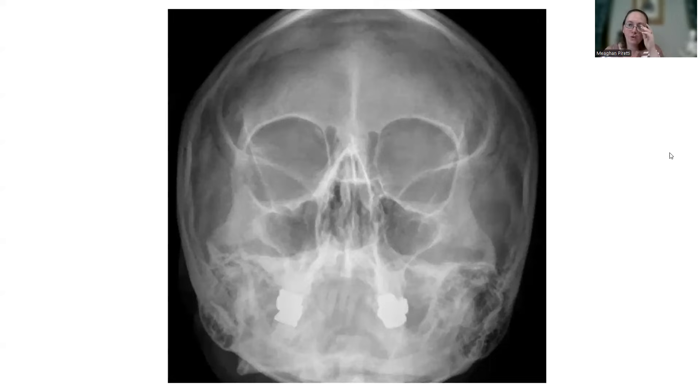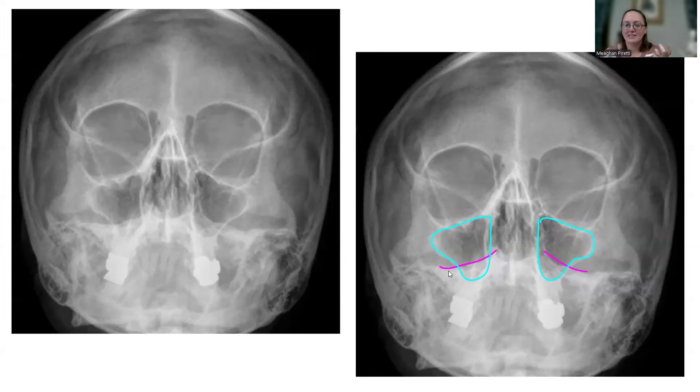If they were too low and you need them to go up, you would tuck the chin. Here's a Waters view — a parietoacanthial — where do we want the petrous ridges? You want the ridges below the maxillary sinus. Find your maxillary sinus; there's a bright white line inside it. That's not where it should be. Here's my arts and crafts: your ridges are inside the maxillary sinuses — too high. You're going to hang 10. Lift the chin up to make them go down. With Waters, that MML must be perpendicular, so the chin has to be way up high.